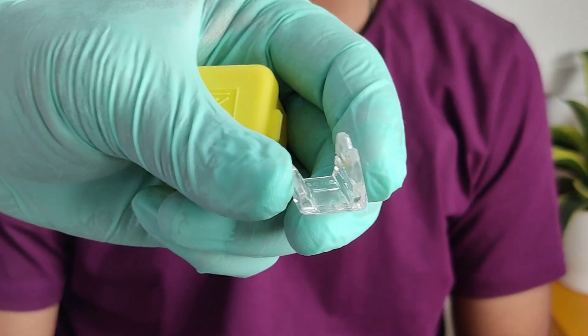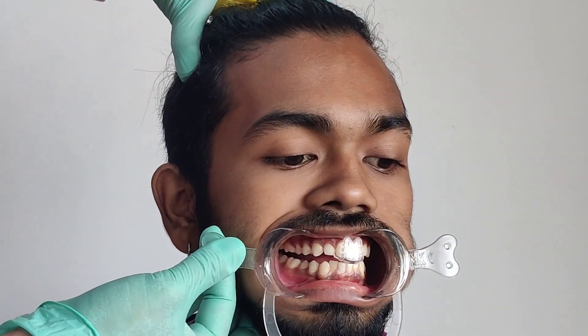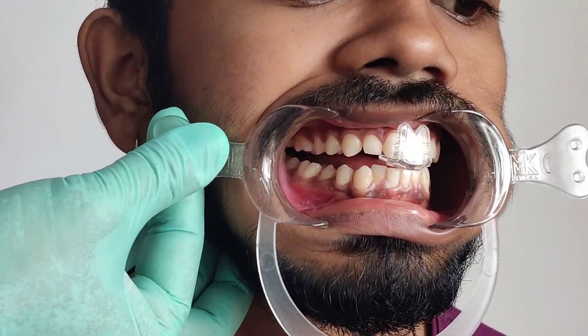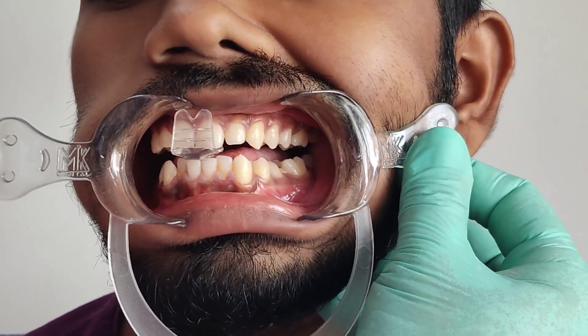Before you reline this, always remember to go ahead and try it intraorally first. Position it on the centrals, bite down, and make sure that it brings about disclusion of all the back teeth. As you can see on the right side, we have complete disclusion. Similarly, on the left side, we have complete disclusion.